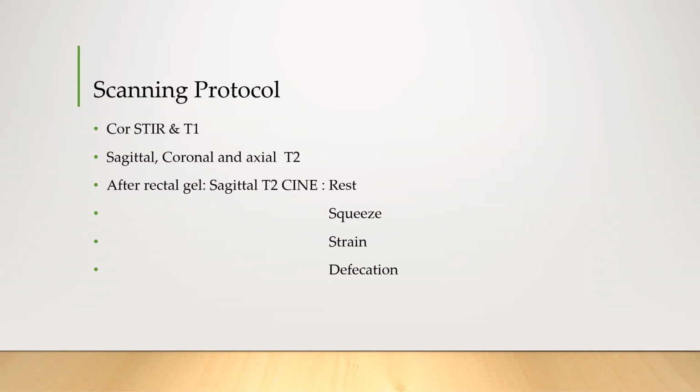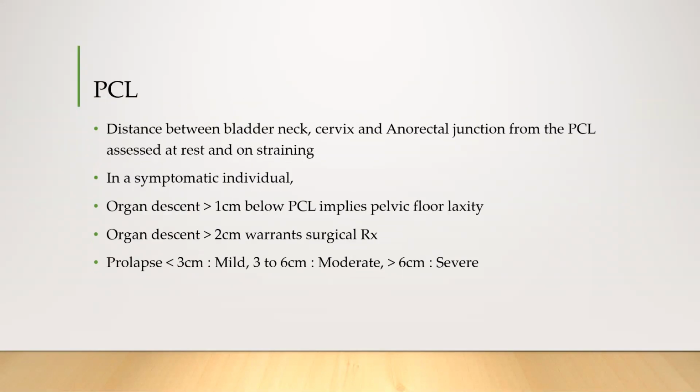As far as possible, the patient needs to understand all these things very clearly because you are having a cine loop which is recording the entire thing. So these are not still or static images. This is a cine loop which you're actually seeing. So you want the patient to be really cooperating and trying to do everything in one go. Otherwise, you would have a very interrupted study, which would obviously impede your impression and the way you would interpret the scan.